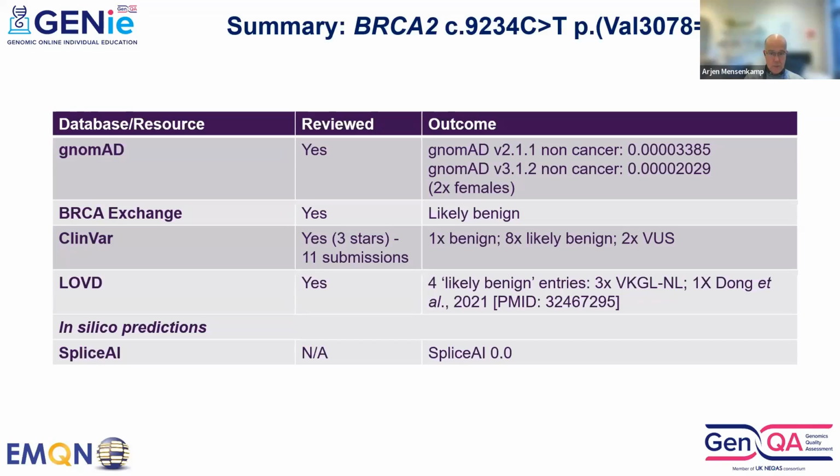It's also present in LOVD, and SpliceAI, which is now the only in silico tool that can be used here, indicates that there is no expected splicing for this variant. Next slide, please.